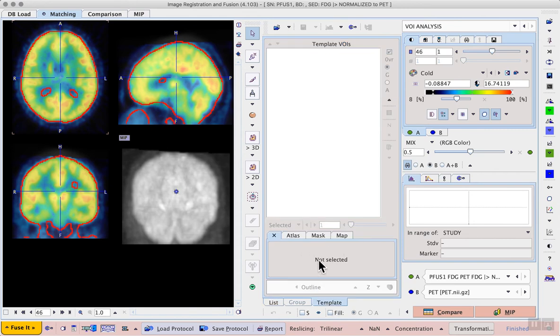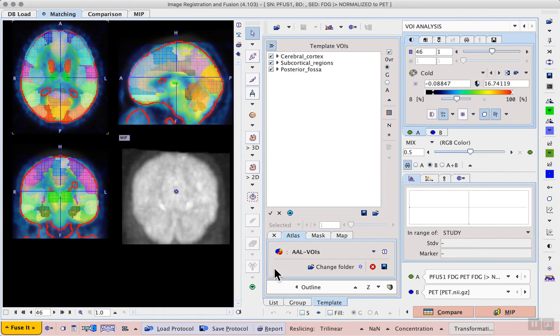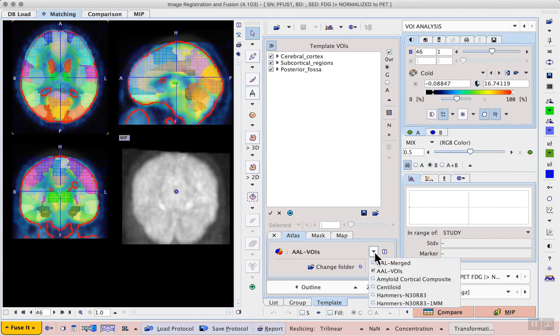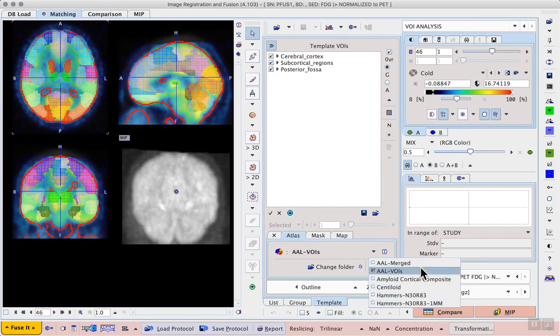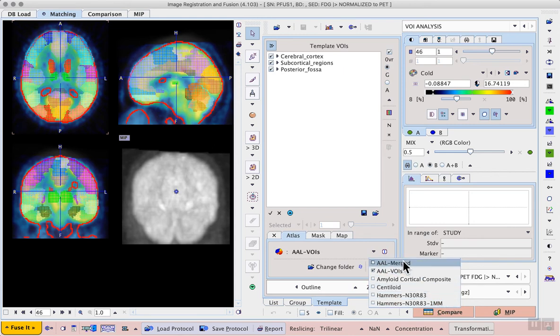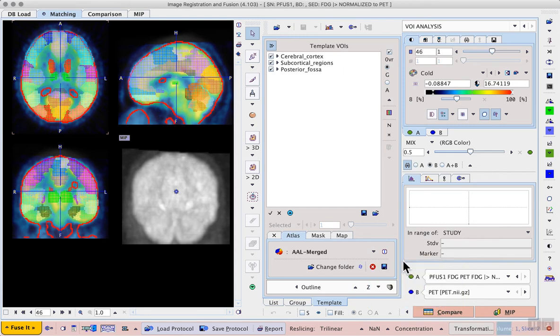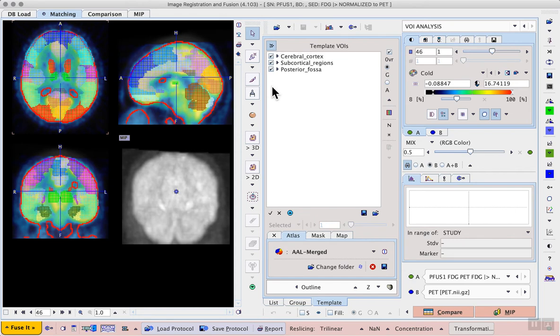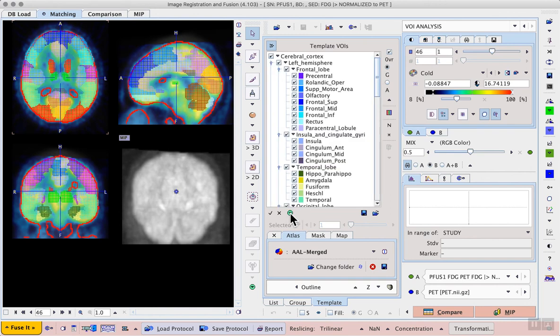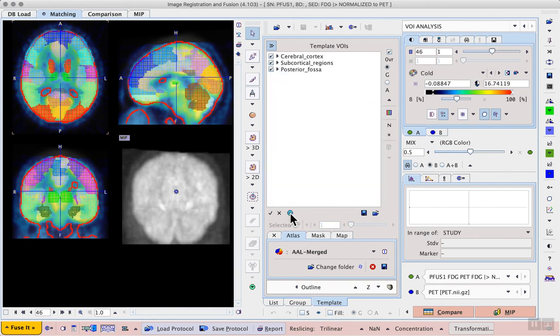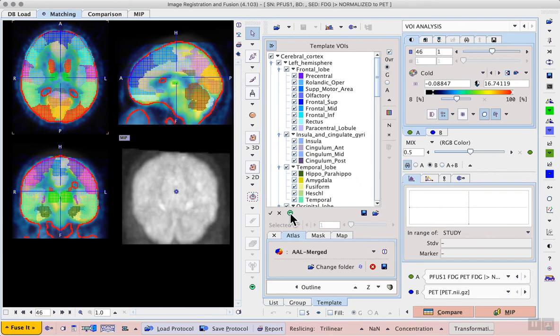Where we see a number of sub tabs, the first of which is the atlas sub tab. Here we have a dropdown list again showing available atlases in this particular template space and for this example we can select the AAL merged regions. A list appears in the template VOIs panel further up, this is actually in a tree structure. With the blue icon at the bottom of the list we can expand or compress that tree structure and I can actually select the regions that I want.